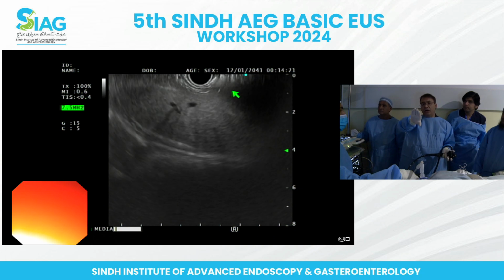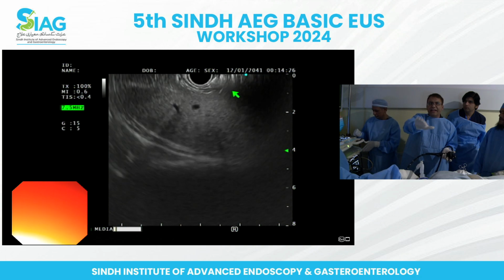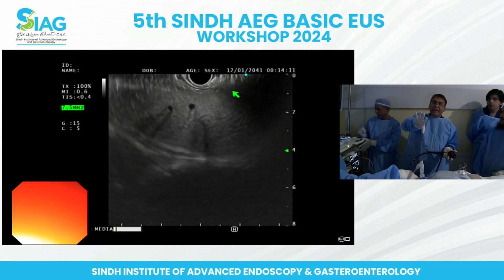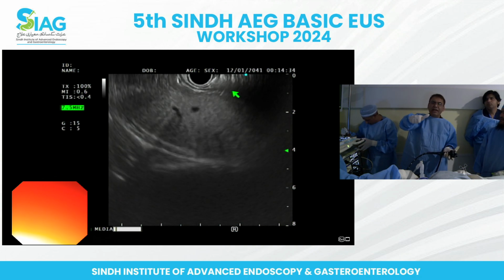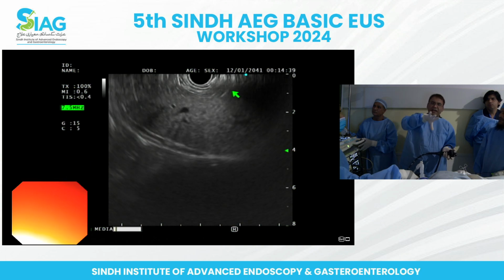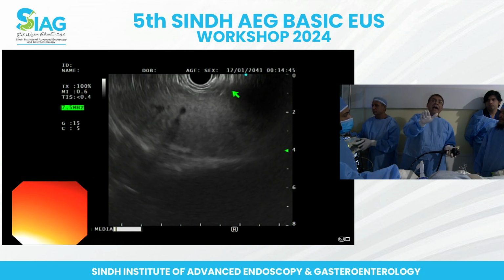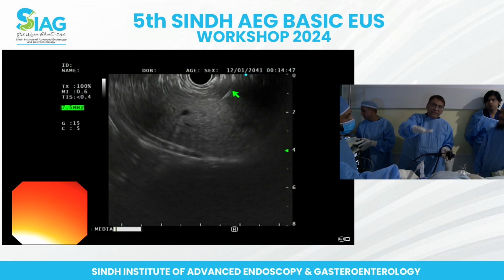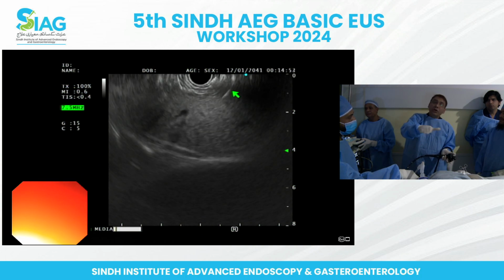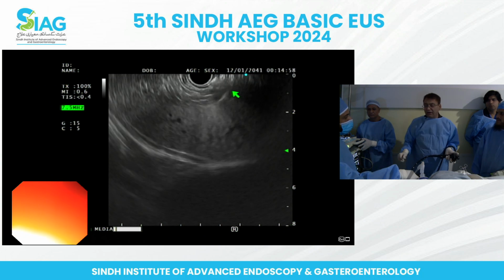Another thing: these liver segments are divided either by the hepatic veins or the portal vein and its branches. The main thing you need to remember is the left hepatic vein, mid hepatic vein, and the right hepatic vein. These tell you about the lobes of the liver from the stomach, and from the duodenal bulb, on the other hand, we mostly depend on the portal vein branches to see the right anterior and the right posterior.